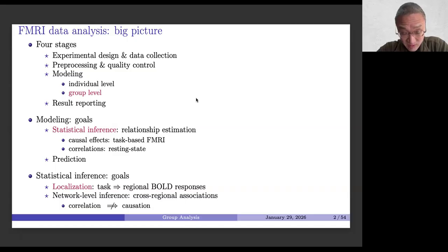Before we talk about the specifics of group level analysis, we want to say something about statistics in general. The dominant approach in fMRI, particularly, is to adopt the traditional framework. It's called null hypothesis significance testing, NHST. When we say statistical inference, what do we mean? We want to say something about the results, based on the p-value or t statistic or z or F statistic, right?